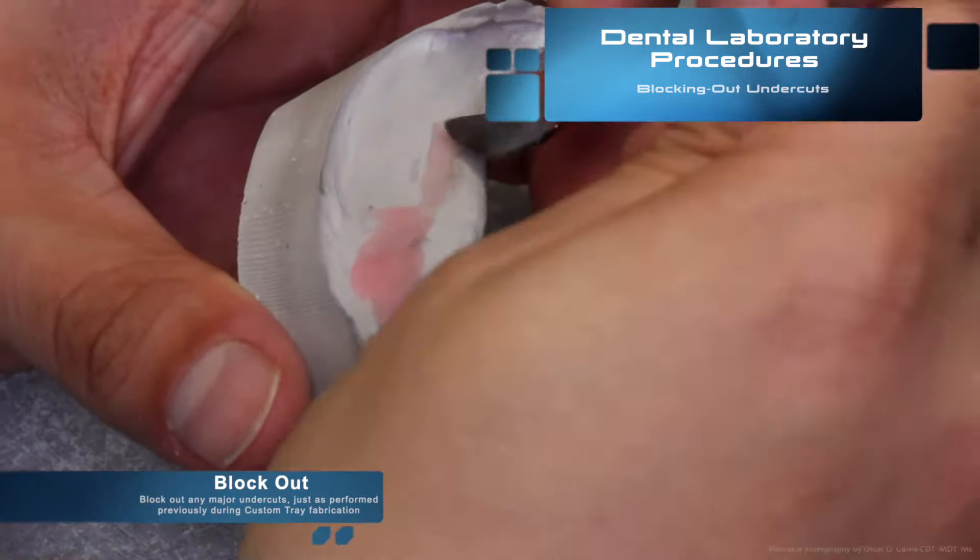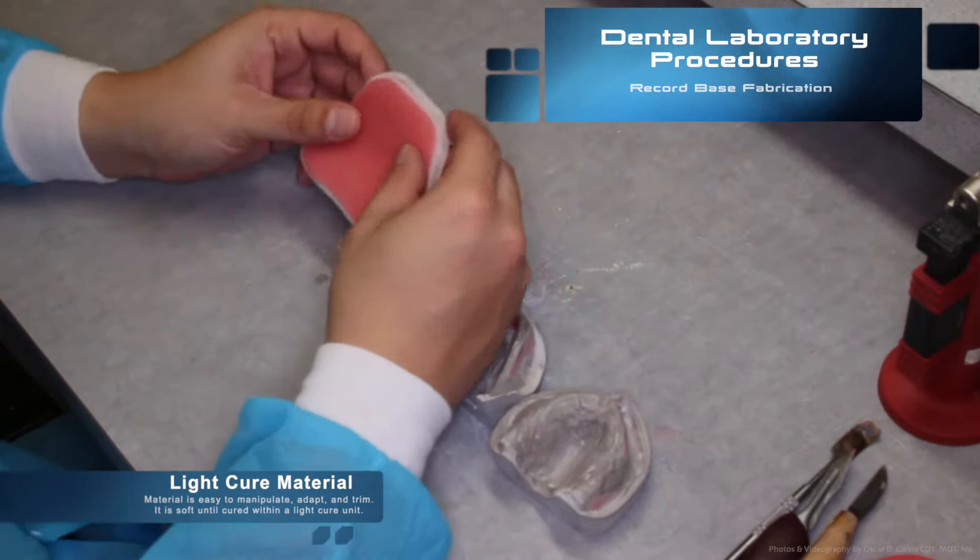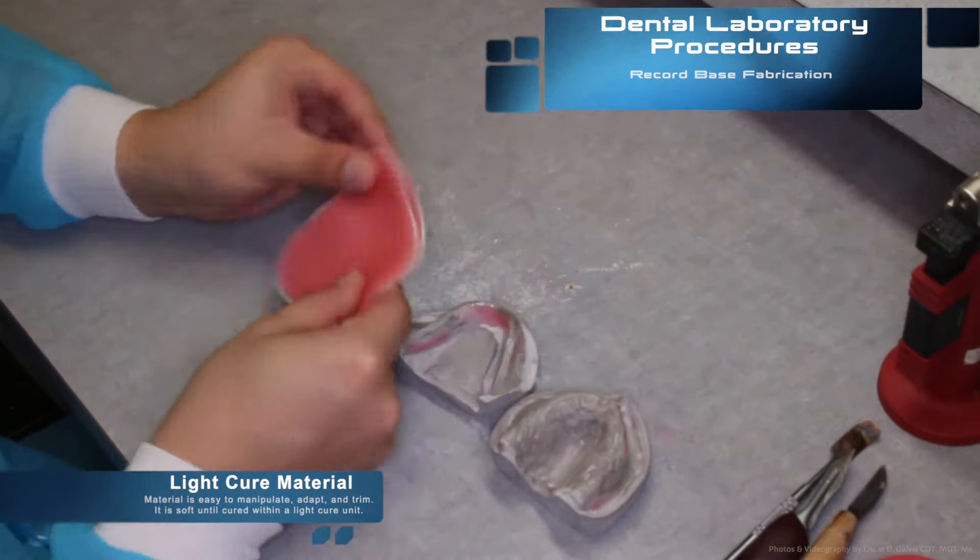Next we begin the record base fabrication itself. We use in this video light cure material. This material is easy to manipulate, adapt, and trim. It is soft until cured within a light cure unit.